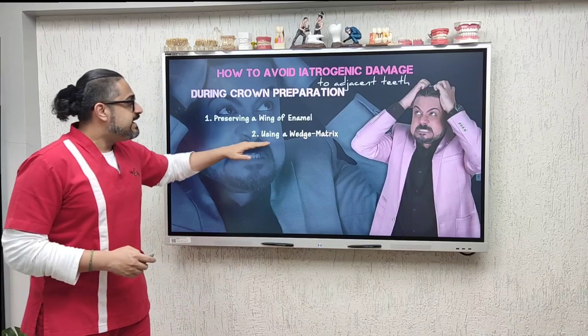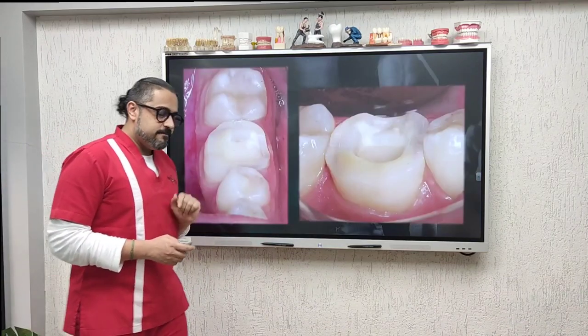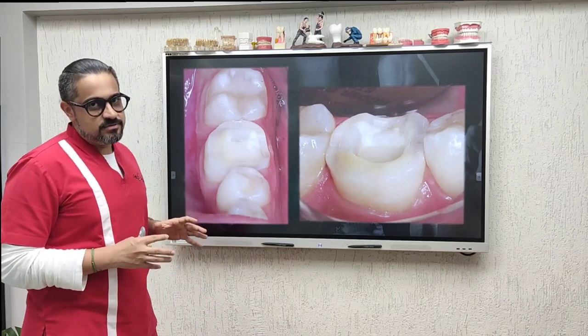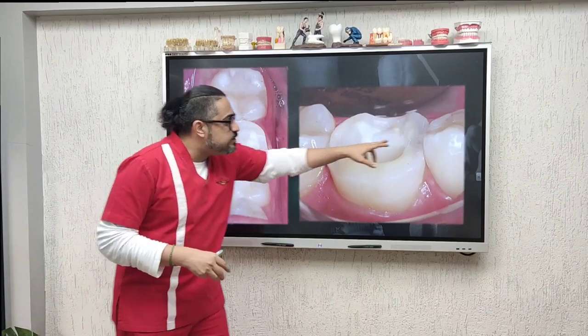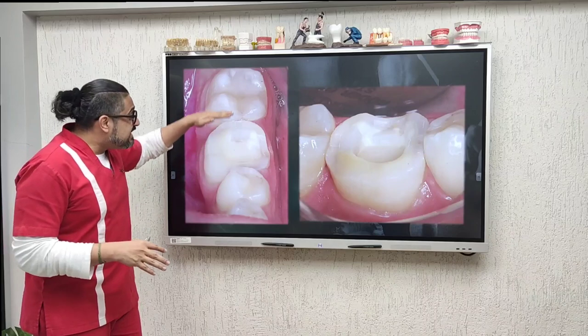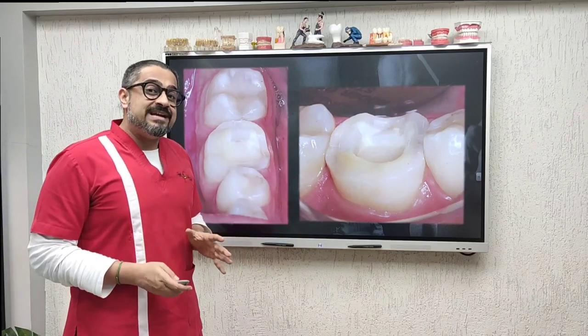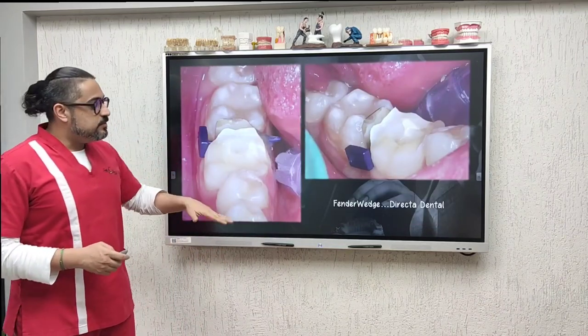The second recommendation involves the use of a wedge matrix. Look here — this is a tooth preparation for a tabletop restoration, basically for a crown lay. In these scenarios we do not actually open the proximal contacts, and yet we need to do occlusal reduction.